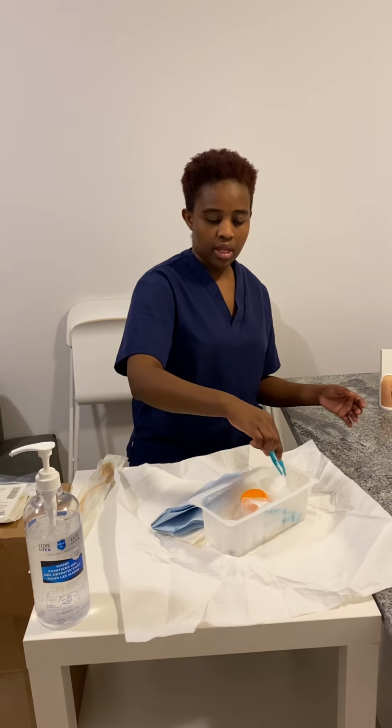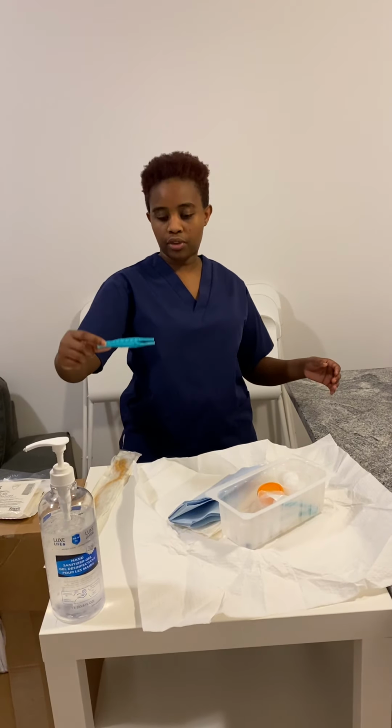Okay, so I'm going to open my catheter. What I'm going to do is put the transfer forceps 1 inch above the sterile border.